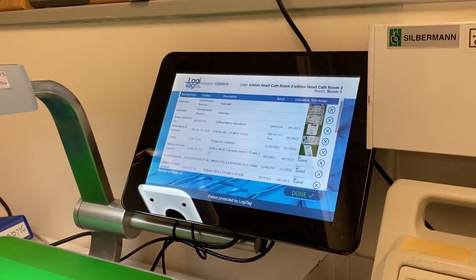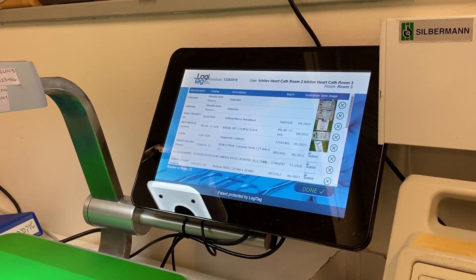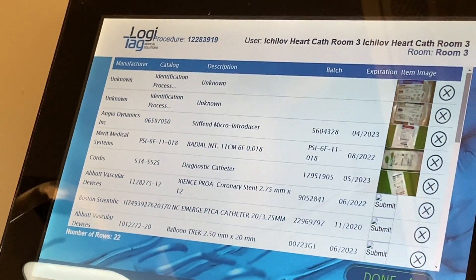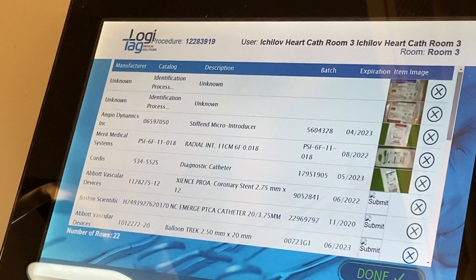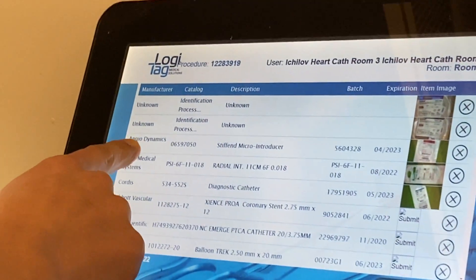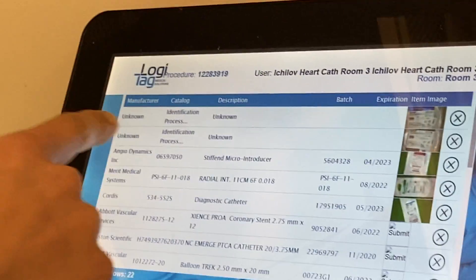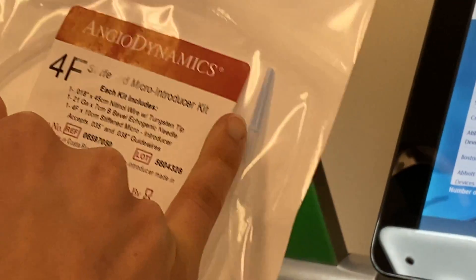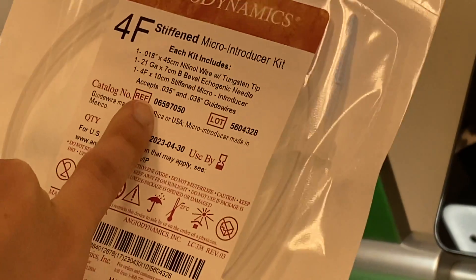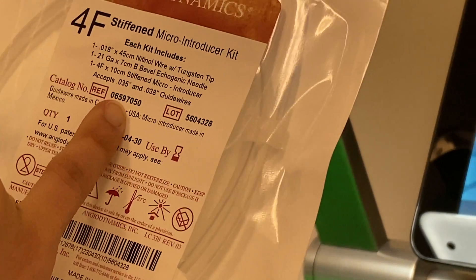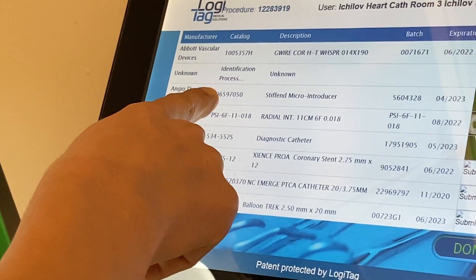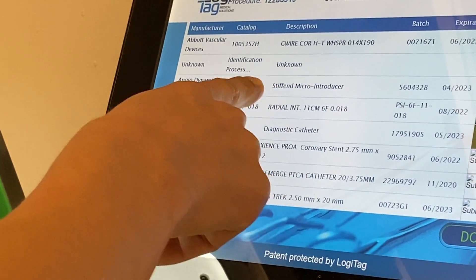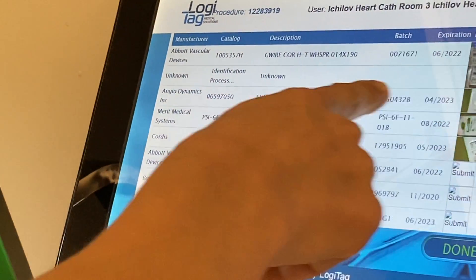As you can see, it identifies items as it goes along — you don't need to wait for it to identify before getting the next one. We can check them to make sure things were identified correctly. Here is the manufacturer: Angio Dynamics Incorporated. The reference number is 06597050 — that's the catalog number.